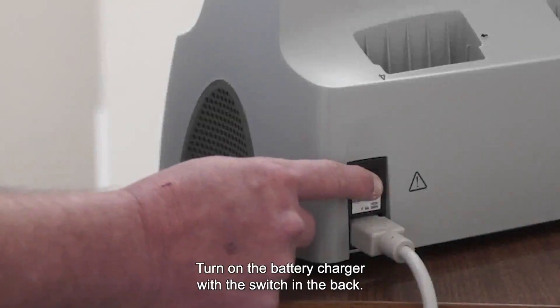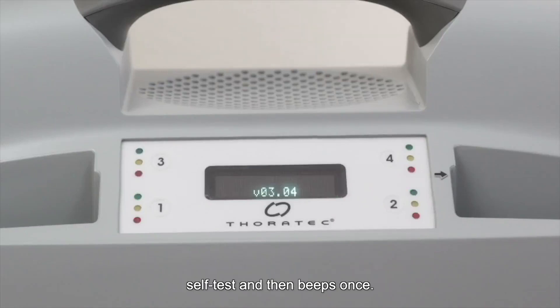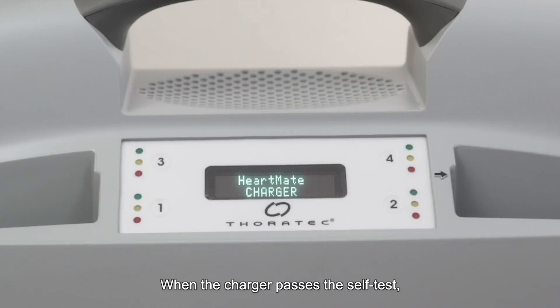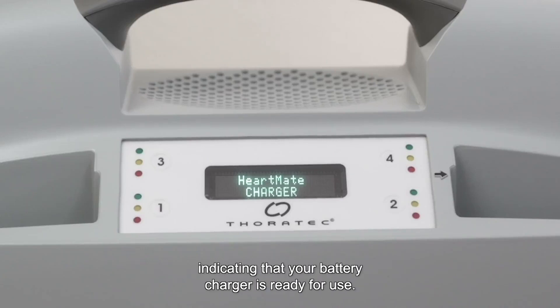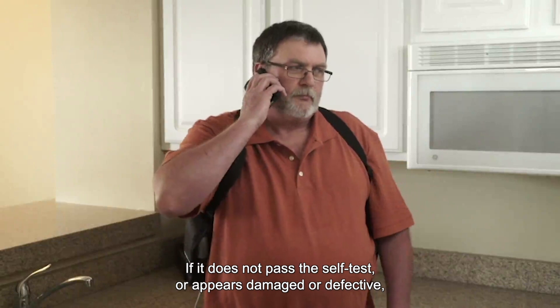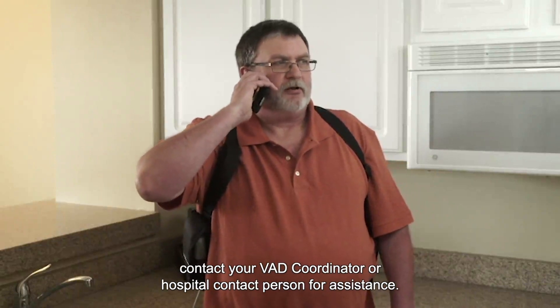Turn on the battery charger with the switch in the back. The front panel lights illuminate and the charger performs a 10-second self-test and then beeps once. Additional beeps sound for each battery in a pocket. When the charger passes the self-test, the message 'HeartMate charger' appears on the display panel, indicating that your battery charger is ready for use. If it does not pass the self-test or appears damaged or defective, contact your VAD coordinator or hospital contact person for assistance.